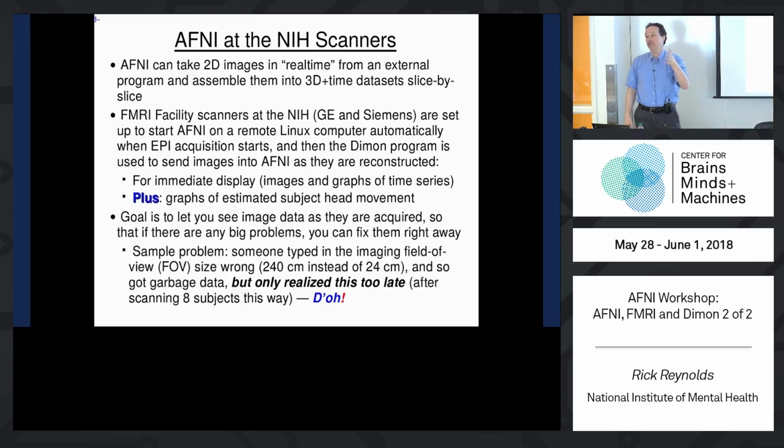And the motion, seeing the motion right up front: you're moving a little too much. Just try to relax and breathe comfortably. Get your whole body as relaxed as possible, and try to move less. Of course, you'll say this anyway, you just assume they're moving too much, but it's nice to see the motion parameters so you get an idea of actually how much they are really moving in the scanner, at least according to the estimates of the software.